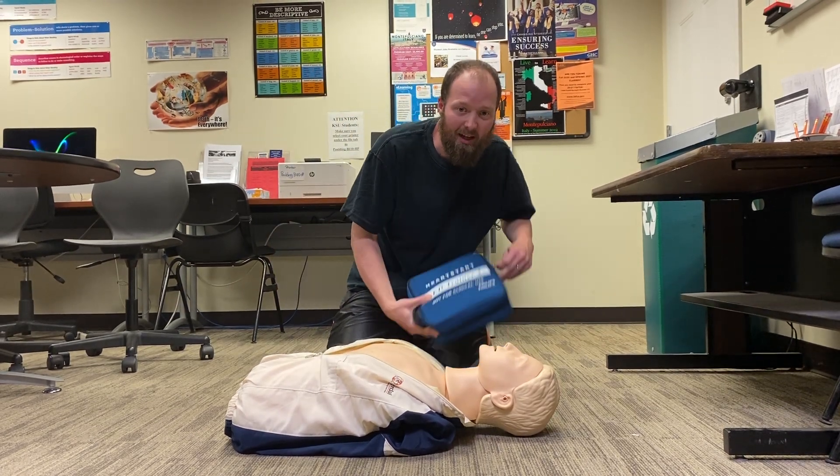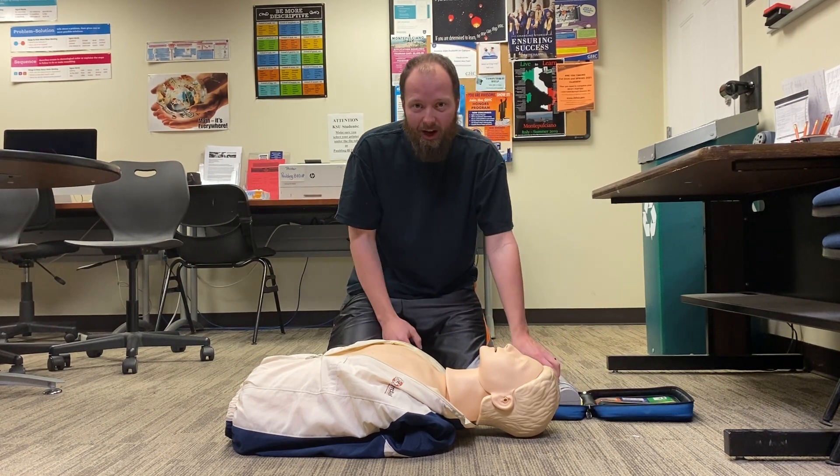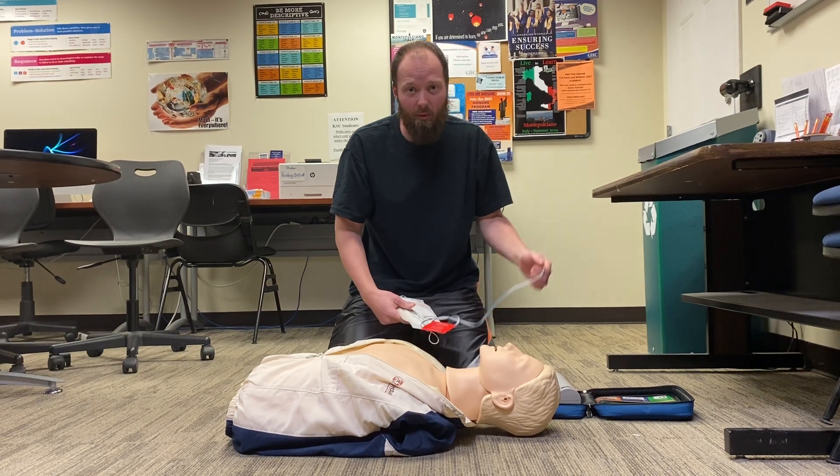The first step with an AED is always to open it — there are various ways. Then from there, always make sure you turn your AED on first. Once you turn that AED on, it will instruct you on what to do next.